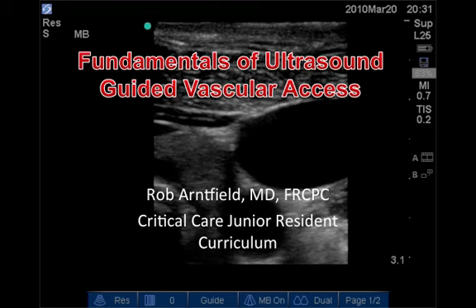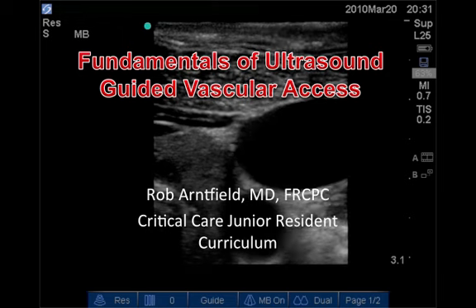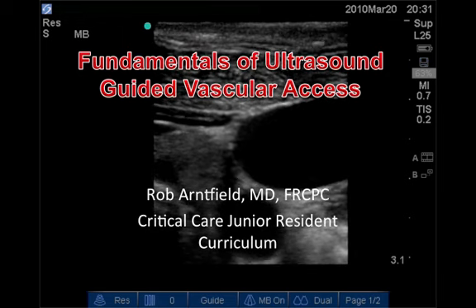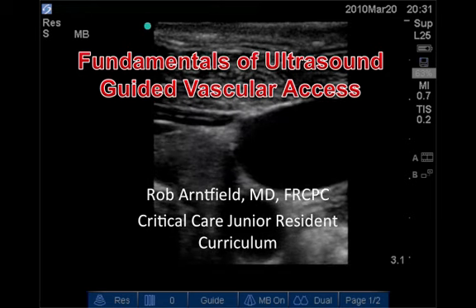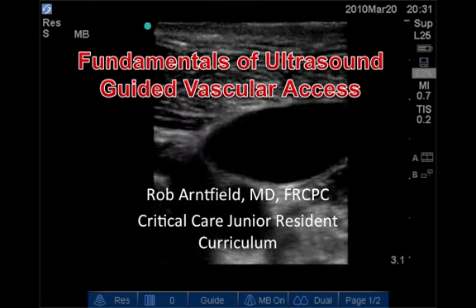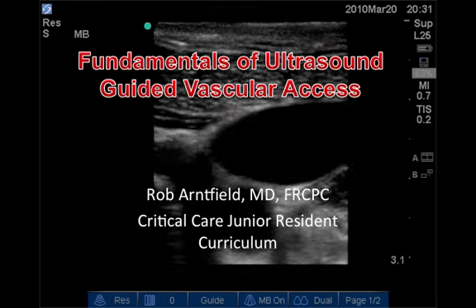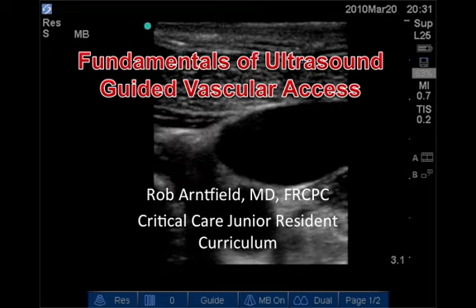Hi, it's Rob Arnfield speaking to you, and this will be the screencast covering the fundamentals of ultrasound-guided vascular access. As a complement to your ICU junior resident rotation, this will be one of the most important procedures you'll perform throughout your rotation and one of the most frequent procedures you will perform as well. So I ask and thank you for your attention as we go through some of these details.